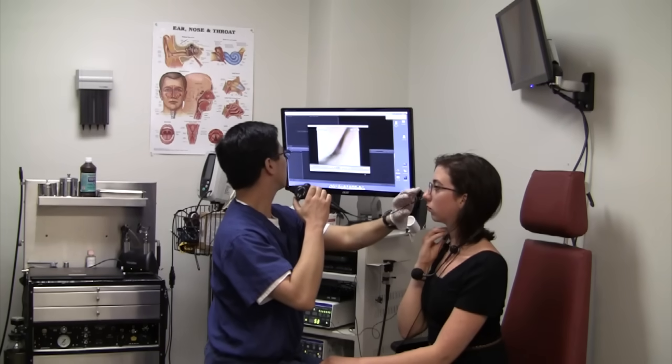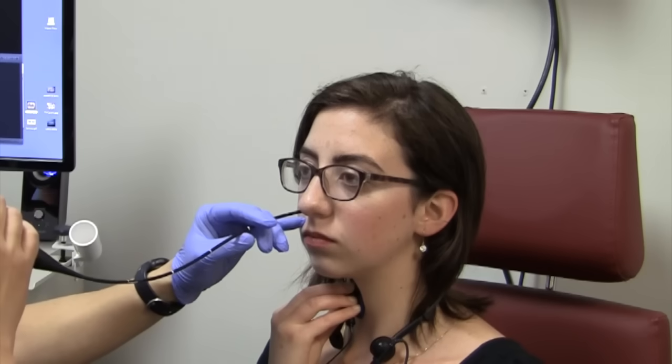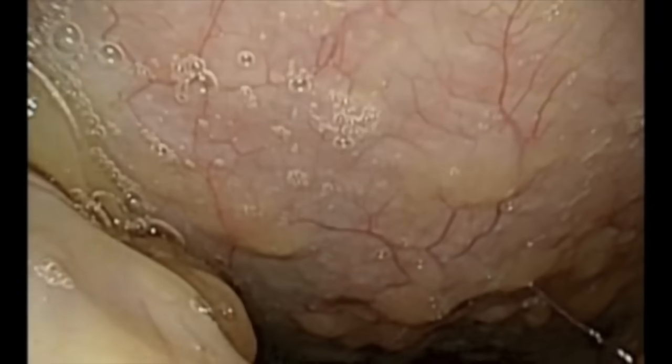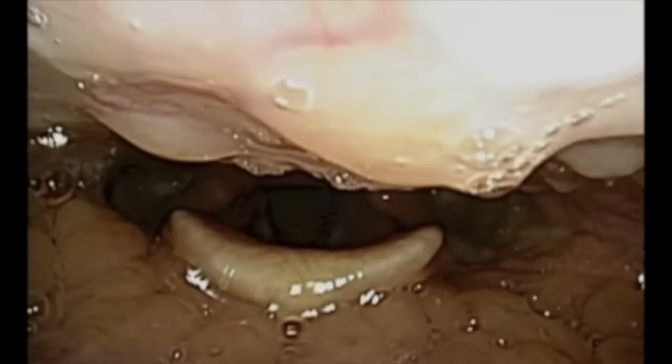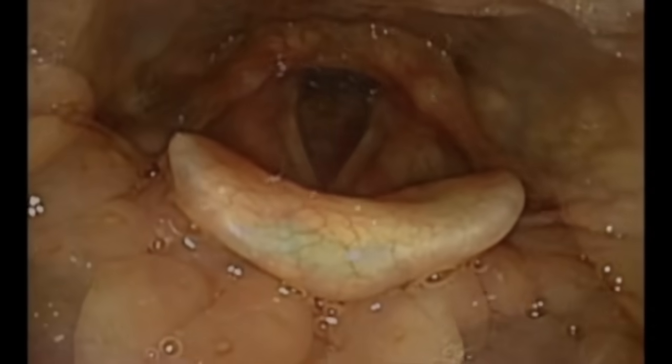Let's take a closer look on the inside. Here, the scope is being passed through the nose. After reaching the very back of the nose, the scope is then bent down in order to visualize the throat. With further advancement, one can see the base of the tongue as well as the epiglottis.